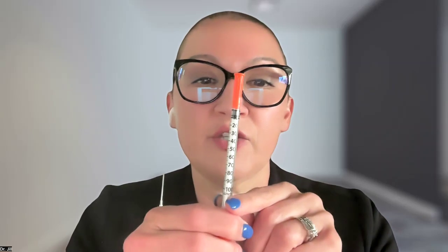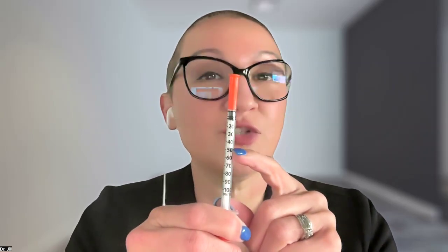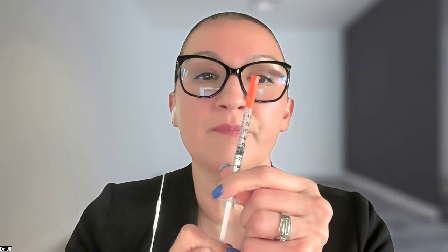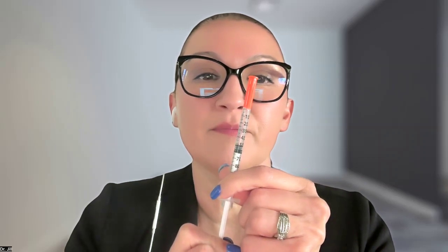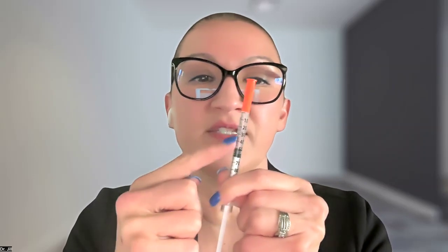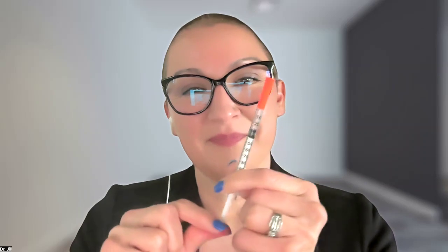But know your number of units and find your number of units on your syringe, on the barrel, and wherever that is where you're going to pull the top part of this black plunger down to. So if I wanted 50 units, the top part of my plunger is going to be right there, because then that is my 50 units.